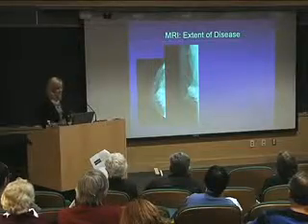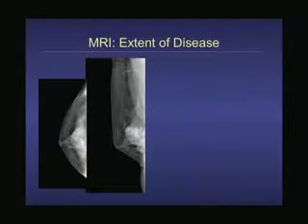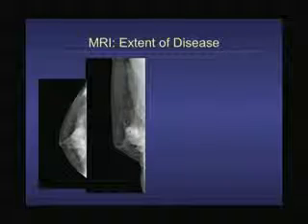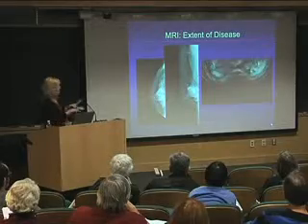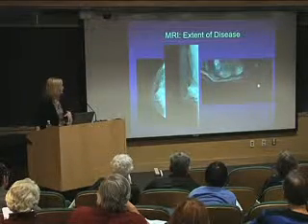So here's an example. This woman had a left DCIS. It was just pre-invasive disease. I'm showing you her right mammogram because she's very dense and we didn't see anything there. And now I'm going to show you this little movie that's going to come up. I'm going to show you the initial, the pre-contrast, followed by right after the contrast and a little delay. The patient's lying down, so the breasts are kind of pendulous. And this is the right breast we're going to focus on.